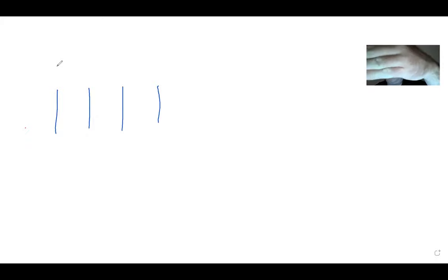All right. So if you were to look at QRSs, right? And if that was a QRS, and that was a QRS, and that was a QRS, and that was a QRS, what you could do, when we say mark something out, is you could take a piece of paper, and you just mark on the paper where the QRSs touch the paper, if you hold the paper like that to the strip, okay?